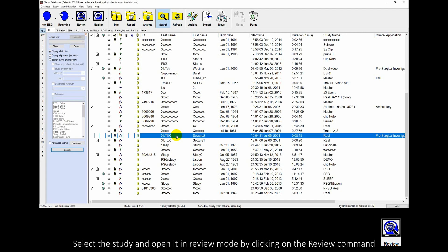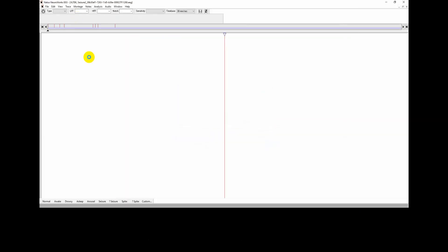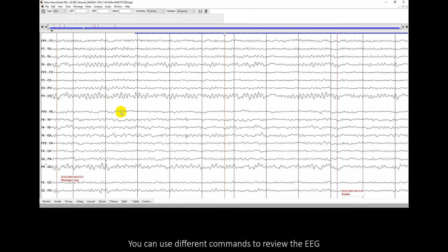Select the study and open it in review mode by clicking on the review command. You can use different commands to review the EEG.